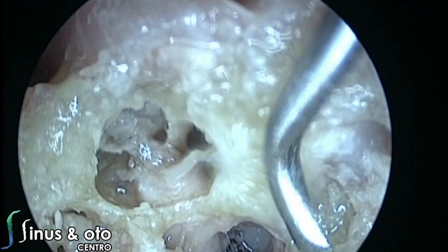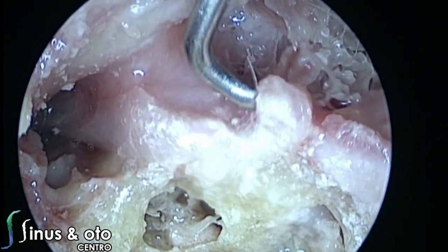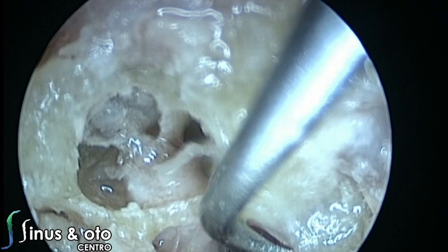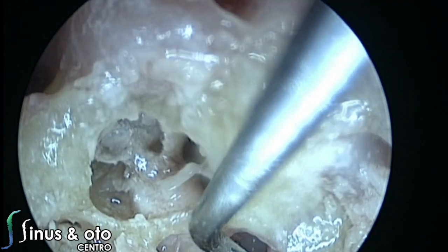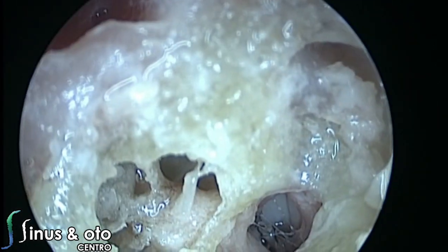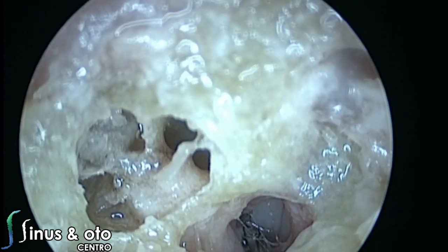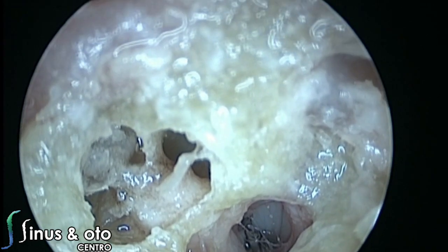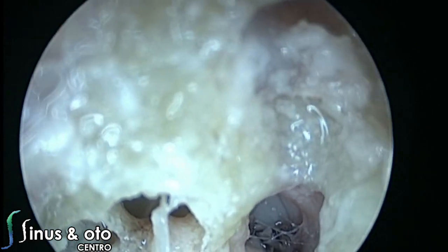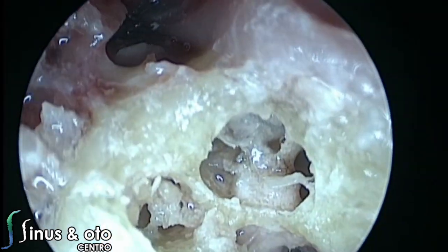So we have all the four cranial nerves that we can see inside the internal auditory canal going to this route. The facial nerve goes in this direction. So the labyrinthine segment of the facial nerve goes superiorly to the geniculate ganglion and then turns into the tympanic segment of the facial nerve. Then we see all the four. You see the facial nerve, that white in the middle of the image, the cochlear nerve in the left, and the two vestibular nerves going into the spherical recess and the elliptical recess. So you see all the four cranial nerves: the facial, superior and inferior vestibular, and then the cochlear nerve going inside the modiolus.